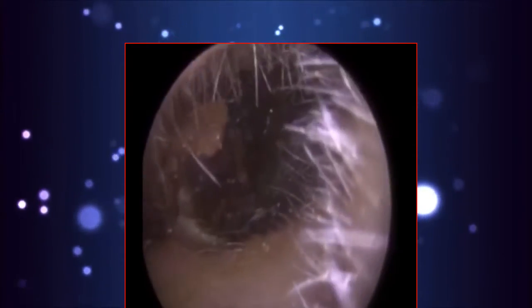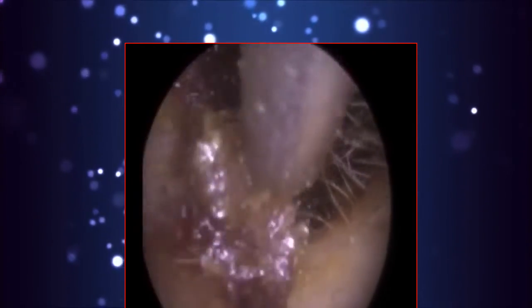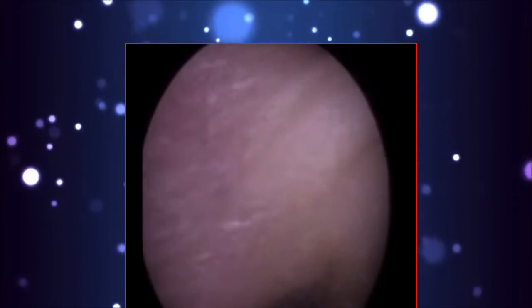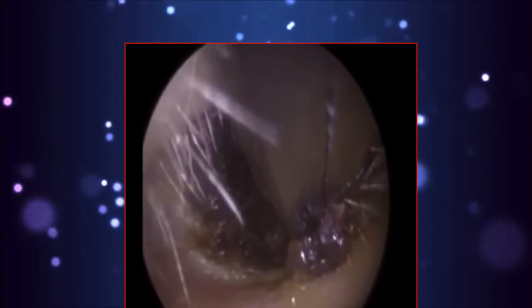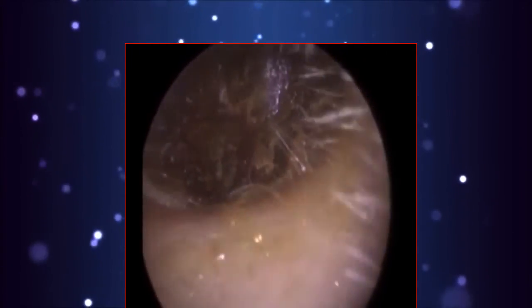But the dead skin, as I removed the plug of wax, some of this skin, the layer of skin, has also become detached from the canal wall, and you'll see blistering. So there was no active bleeding, there was no cut, we didn't cause any trauma ourselves. It's just the physical removal of the wax and the keratin that came out with it. The keratin detached from the canal wall, and it just left blistering, that sometimes happens in earwax removal, but it wasn't any direct trauma caused by ourselves.